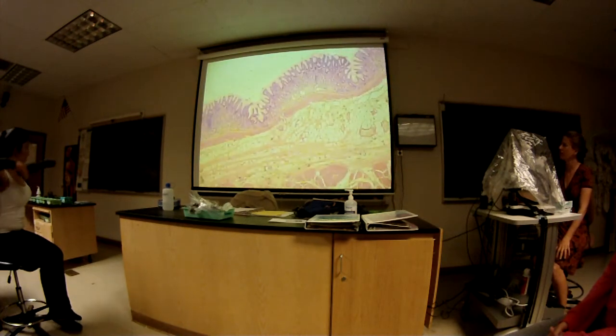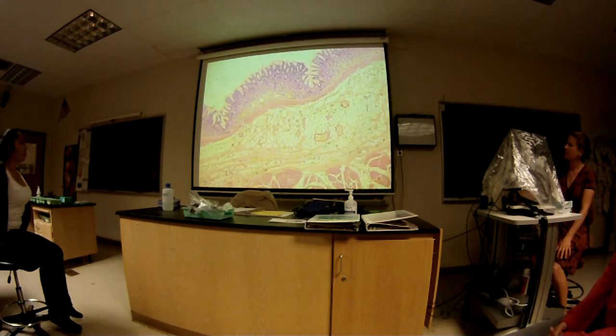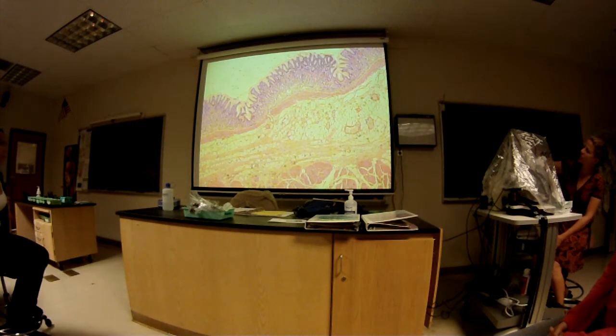Okay, a little tougher for main layers. Some of the organs, the main layers are very clear and some not so much. This one, it's okay. It's just not super easy, as some of them are. Well, none of them are super easy, but more definable.